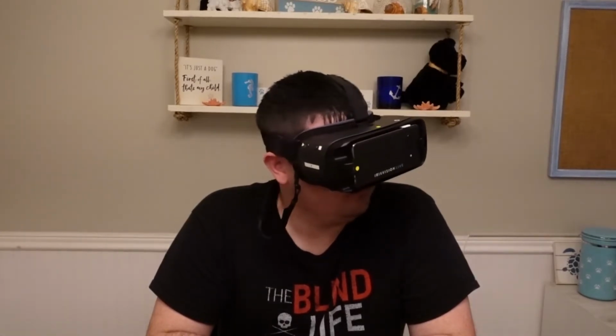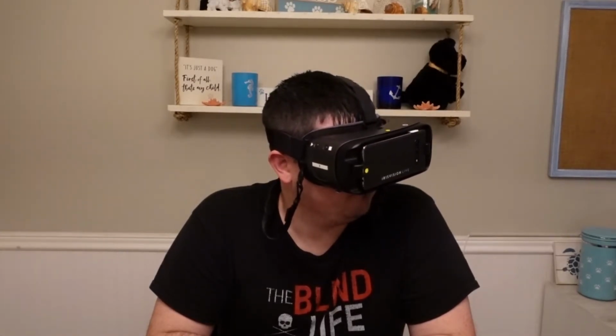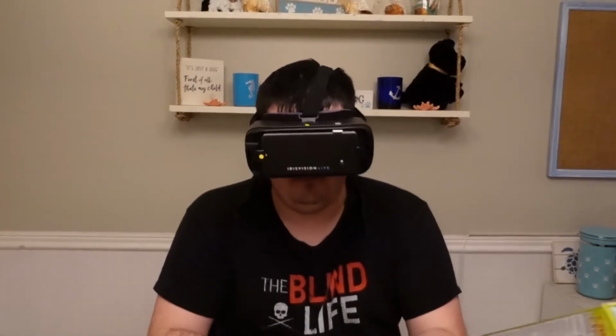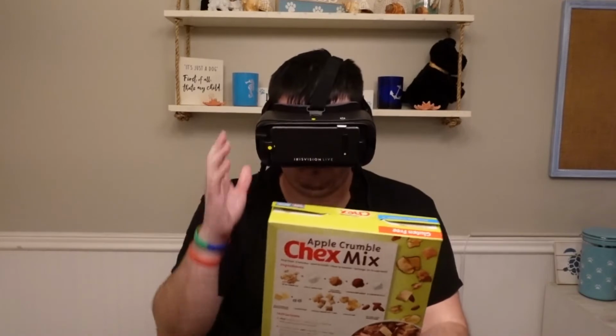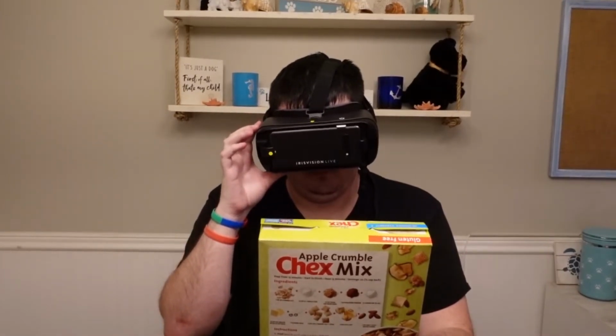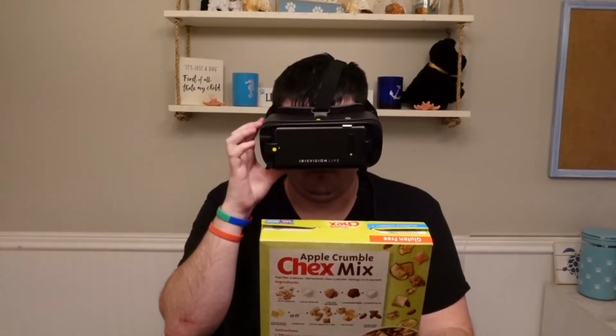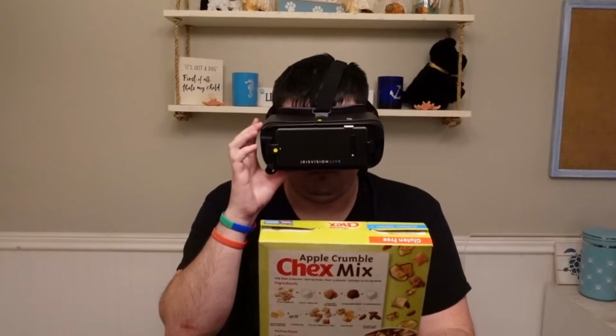Now, would this work on something product-wise? It's possible, if you would like to try. Yes. I have a box. Okay. Here you go. It's still talking to me. How do I get rid of it? Finished readout. There we go. Text to speech speed set to normal. So basically you press the mode button and it gets rid of what's saved.